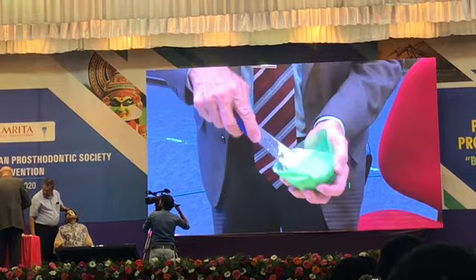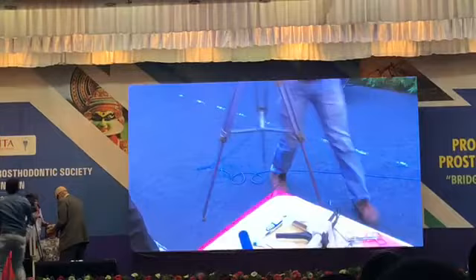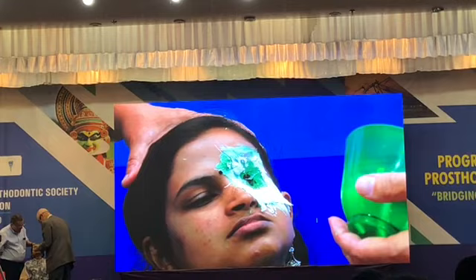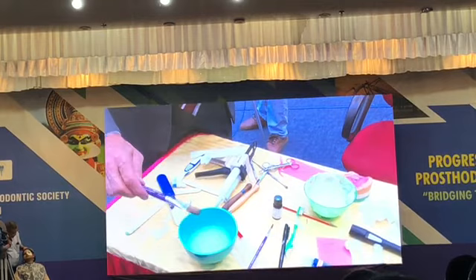Let's see how fast this is. Okay, where's the brush? Here it is. So you take the brush and just a thin layer. This is setting real fast, which is great. I like that. Yeah, it wasn't 5 minutes. Okay, let's do another one here. Another one. Yeah. Just have to be faster. Yeah, okay, go ahead and mix another one.